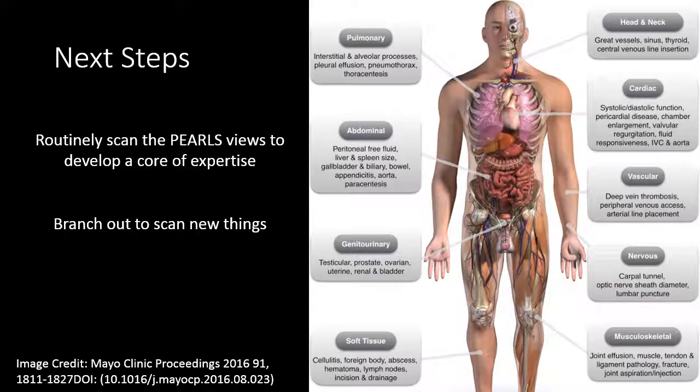And for me, I think the next steps would be to continue to develop that core of expertise and then branch out. There are a tremendous number of applications for ultrasound. And what I've learned from Dr. Botten is that often it's just a matter of, you see something on the body that doesn't look quite right. You want to look past the skin. You just put your probe on it and you can look past the skin and see what's down there.